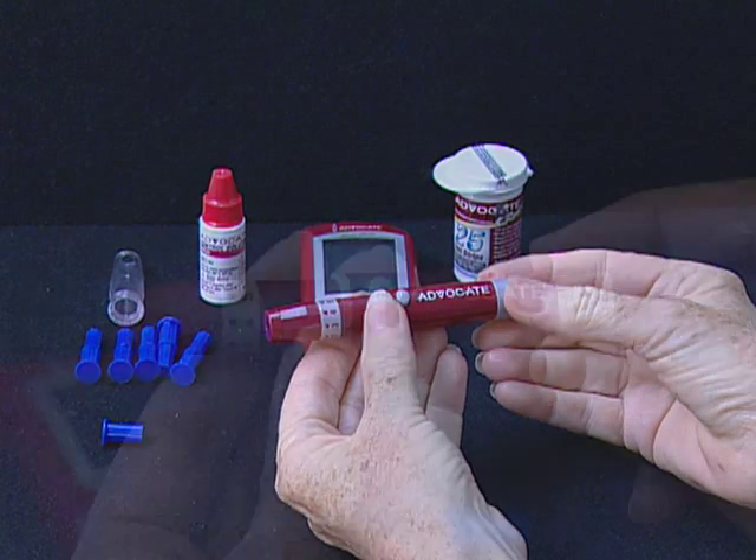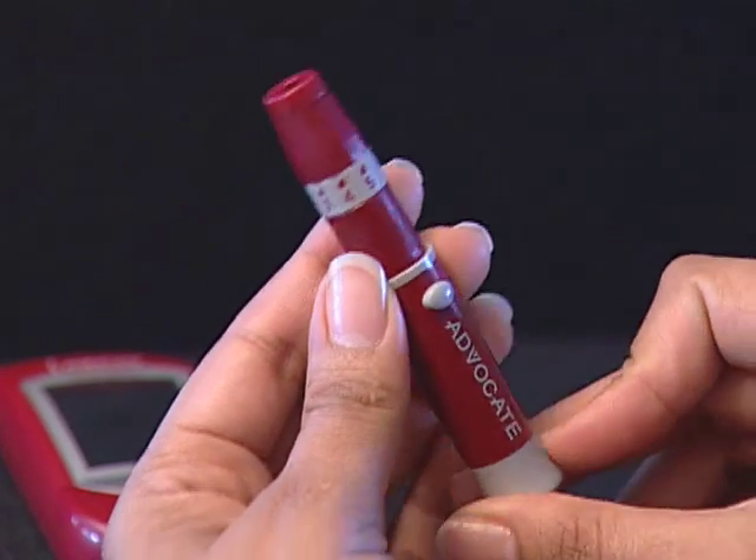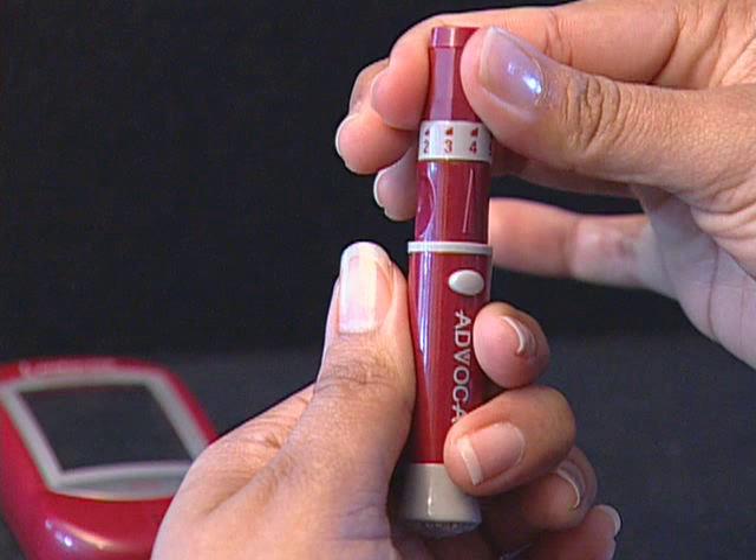Turn the cap until it is snug but not too tight. The adjustable tip offers five levels of skin penetration. Twist the adjustable tip in either direction until the number lines up with the arrow: 1-2 for soft skin, 3 for average skin, and 4-5 for thick or calloused skin.